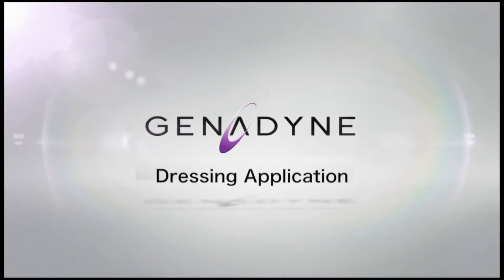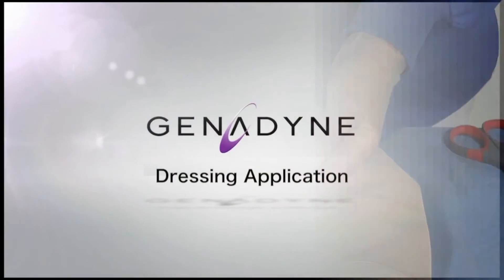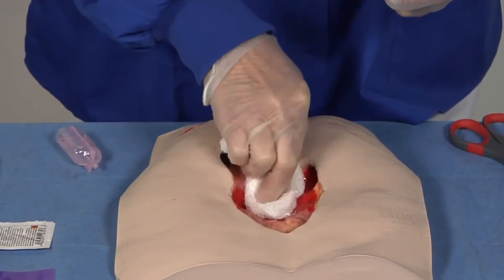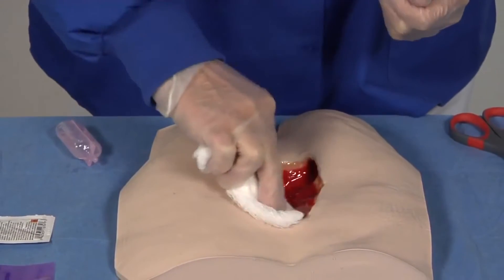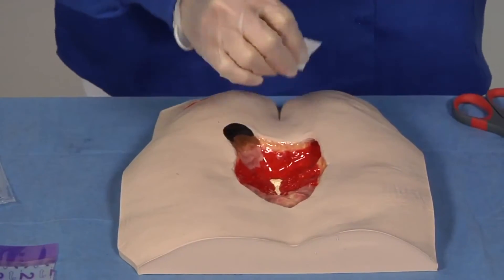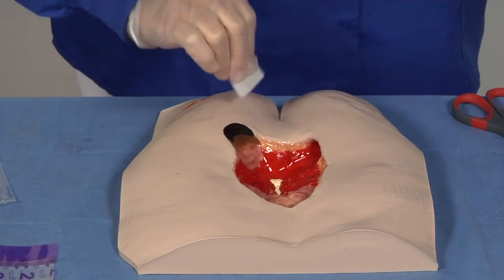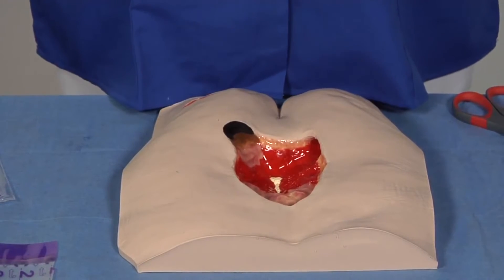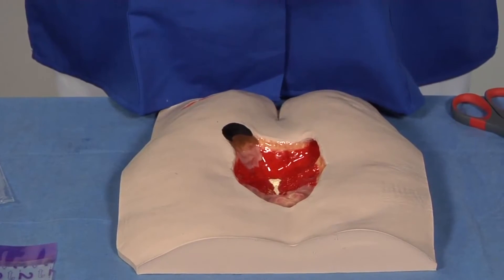Dressing application. First, cleanse the wound with normal saline or per facility protocol. Second, apply skin prep to the peri-wound area and let dry. As an option, transparent film may be applied to protect the peri-wound area using a windowpane method.